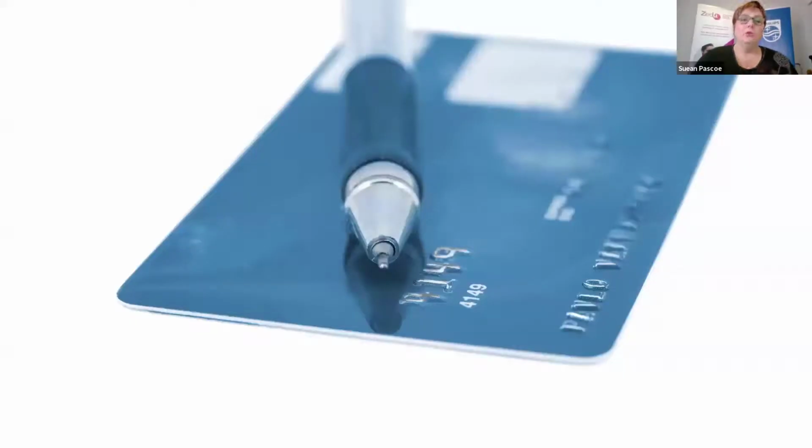Remember that the ultrasound beam thickness is about the slice of a credit card. Now this is what, way back when we first started teaching, and I'd never put a needle into anything, and we got our first phantom.